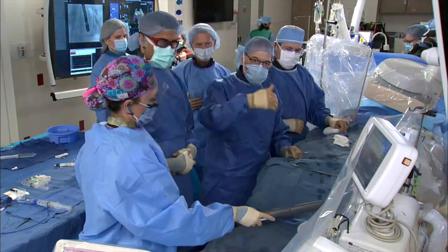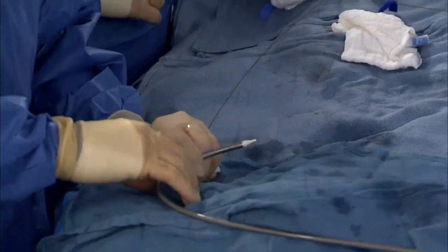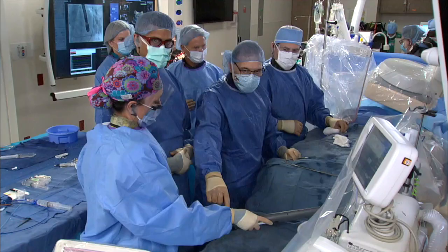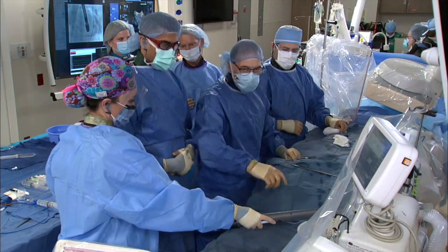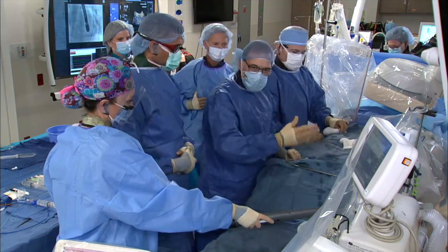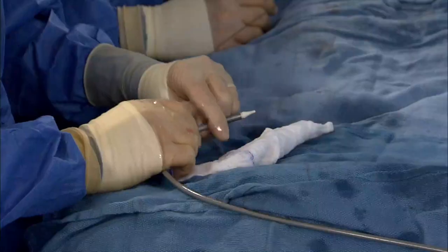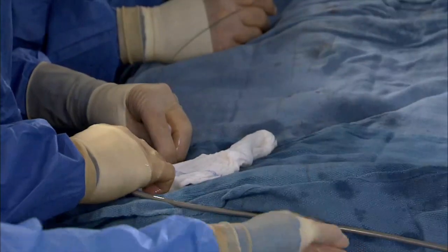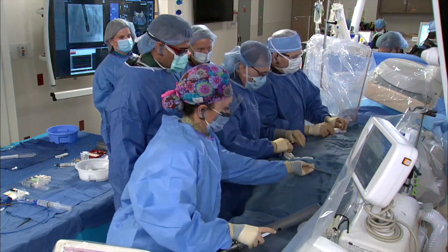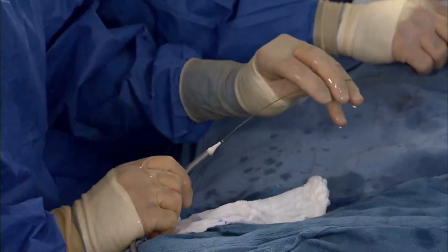Right. We're going to do a little zoom here so you can see that when we go in through a right femoral access, there's an S shape to the device on the table. And when we go in through a left-sided access, there's a Z shape or a question mark shape to the device. That's just the orientation that works best. Now, Bob, when I hand this off to you, what are you looking for on the nose cone? Zoom right in on that nose cone.